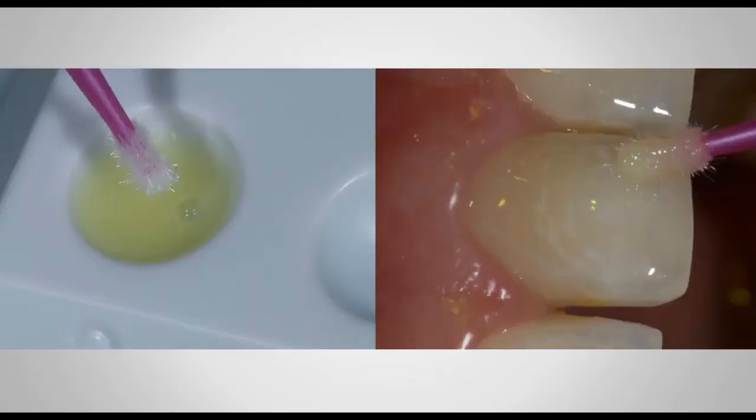My next step is going to be to apply the adhesive. And at this point, you're not only going to apply the adhesive on your spot etch, you're going to apply the adhesive on the entire surface of the enamel. Why? Because you want to make sure that your prototype doesn't stain. You don't want it to chip off or fracture in the gingival aspect.